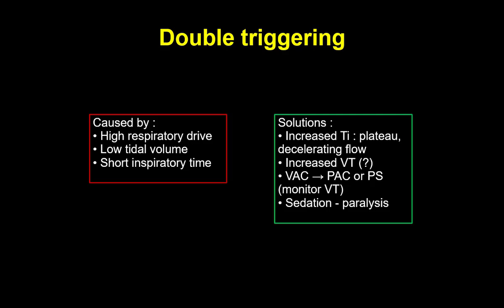So instead of shifting from a volume control, you can shift to a pressure targeted mode. Increase the tidal volume, but this is not a thing which you do in ARDS, so that is a possibility, but we should not really follow that.